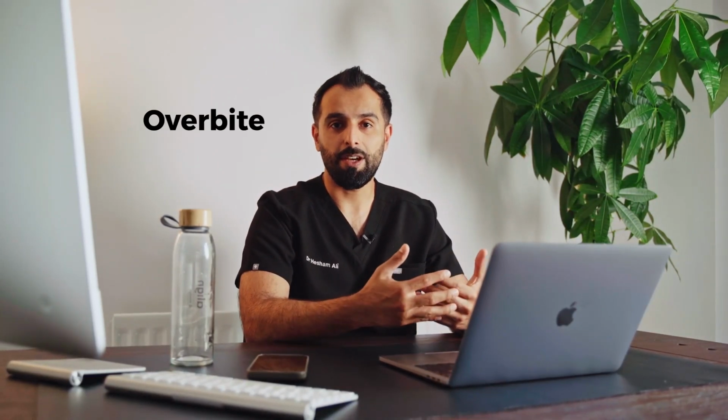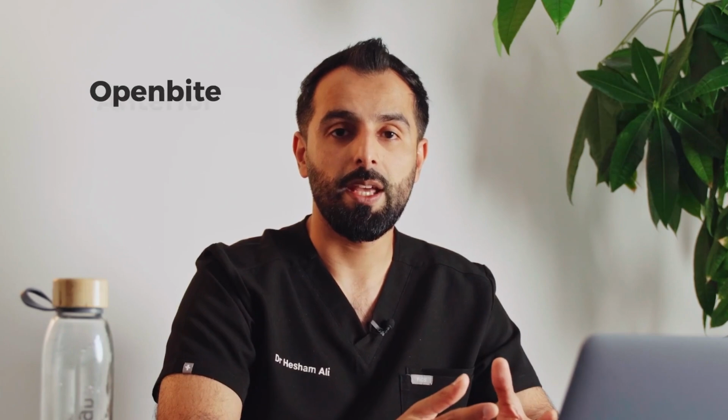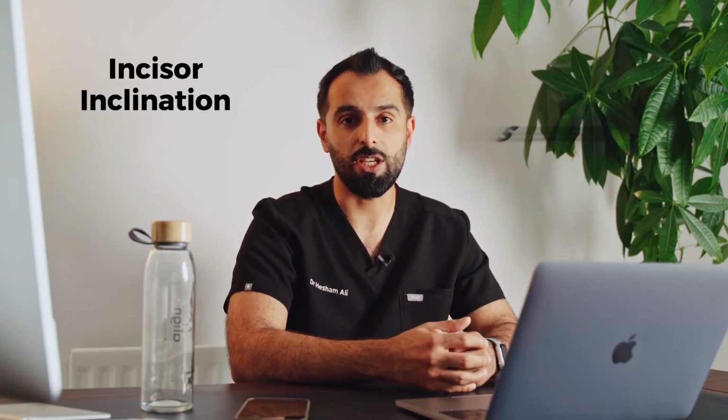Similarly, when we're talking about overbite, we need to try and identify for the technician how we're going to correct this vertical relationship. Now, most cases tend to have an increased overbite rather than a reduced overbite or anterior open bite. And so most of the overbite correction that we achieve with aligners specifically tends to be a relative correction. So it tends to be achieved by some incisor inclination changes and sometimes by getting some posterior extrusion as well. It's not really true incisor intrusion that we're achieving. So it's important to figure out in your case what is the method of overbite correction and try to define that in a clear way.